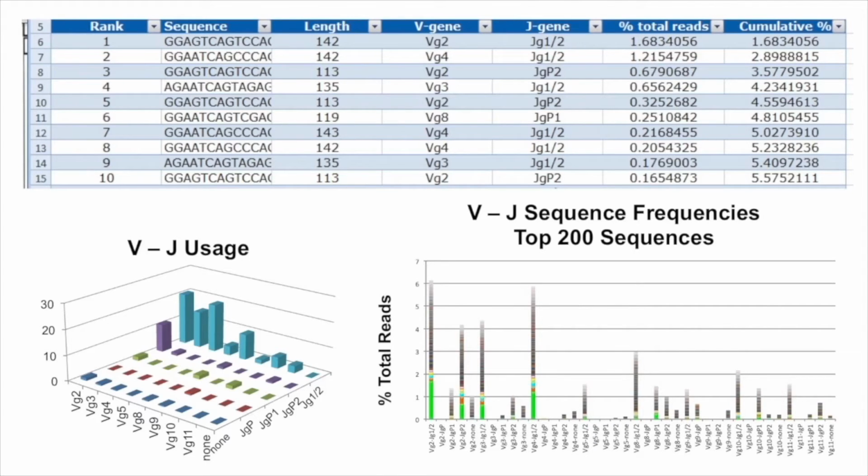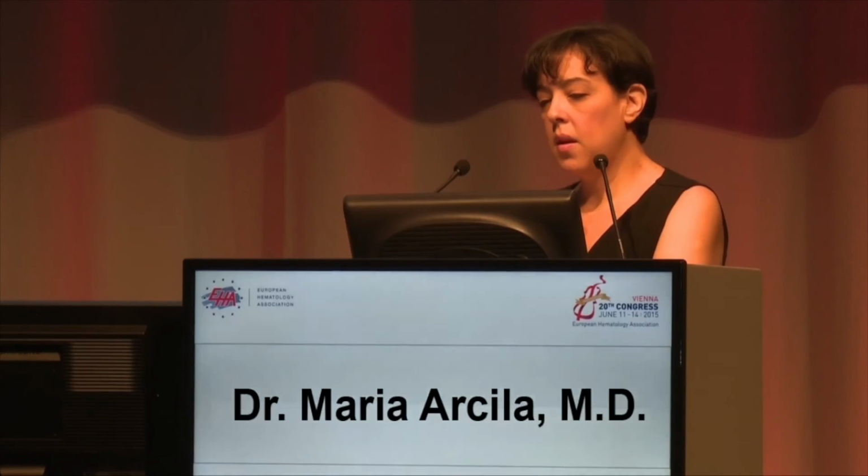But the call of a pseudoclone or residual disease or recurrent disease is very easy with the LymphoTrack assay. We just go back to all of the sequences that you're getting, and for this, we could not find the sequence anywhere in any of the runs that we did. So this patient was free of disease, and we were able to say this was a pseudoclone. This patient doesn't have any disease. The patient is still okay with the transplant that he has.